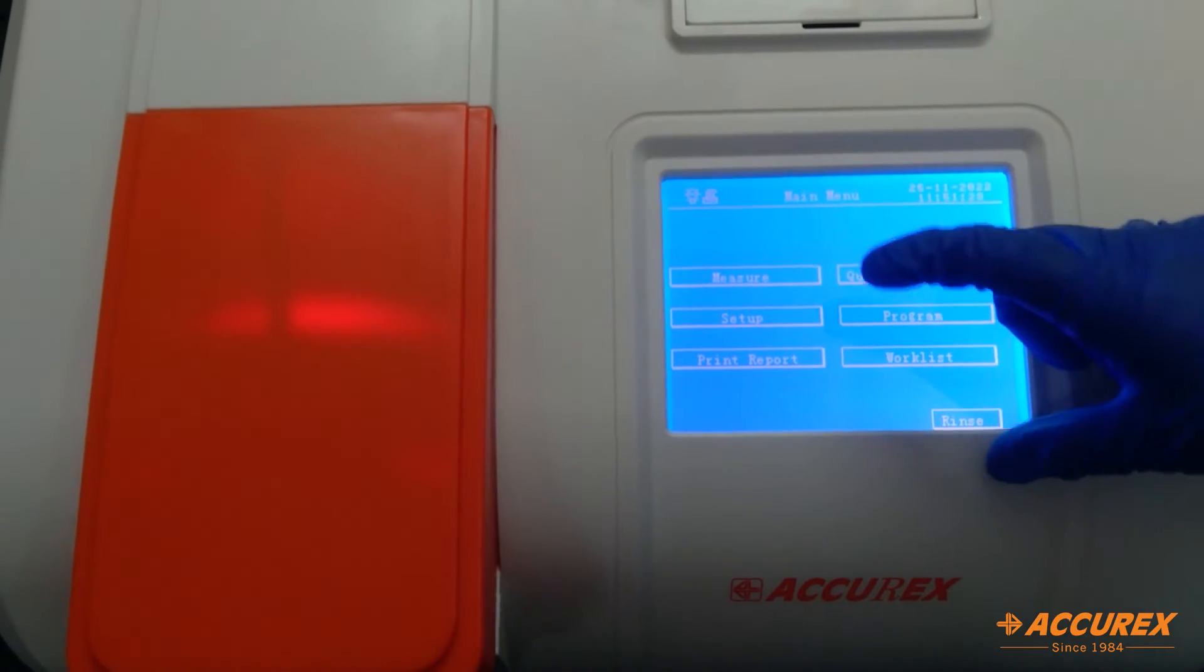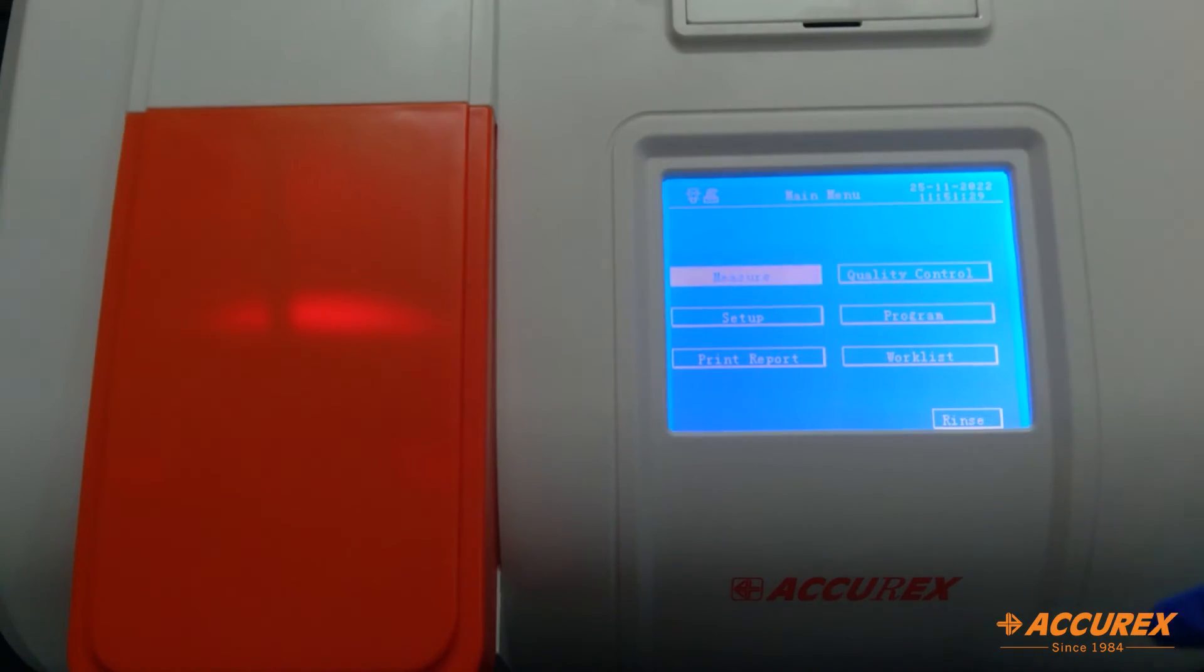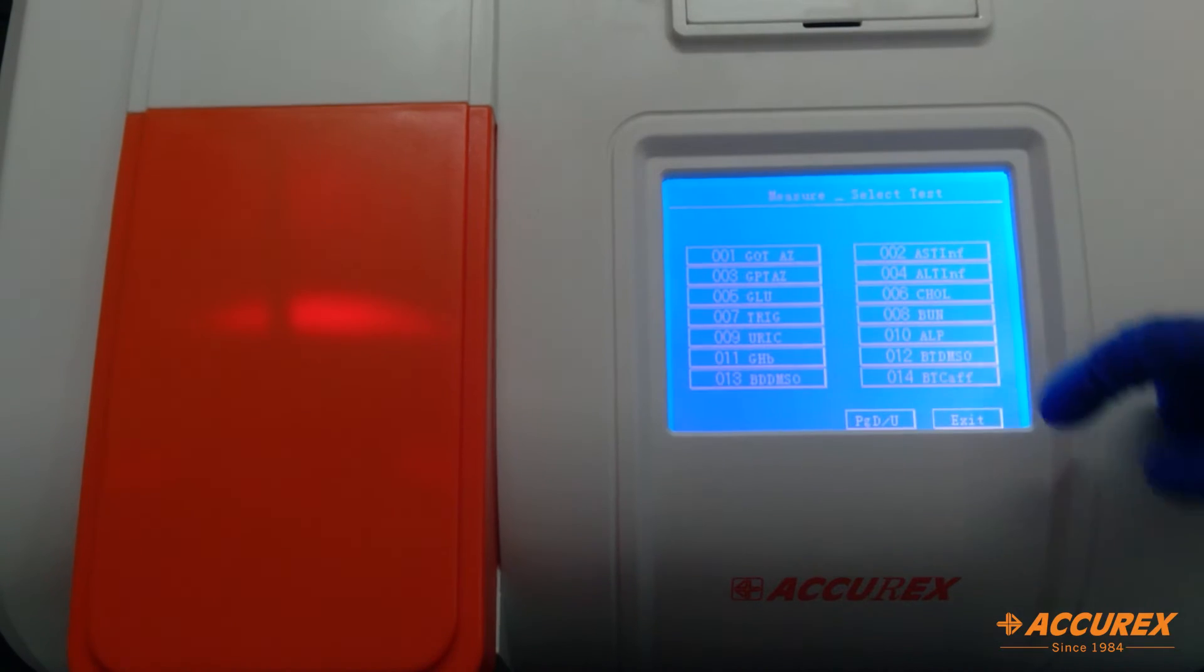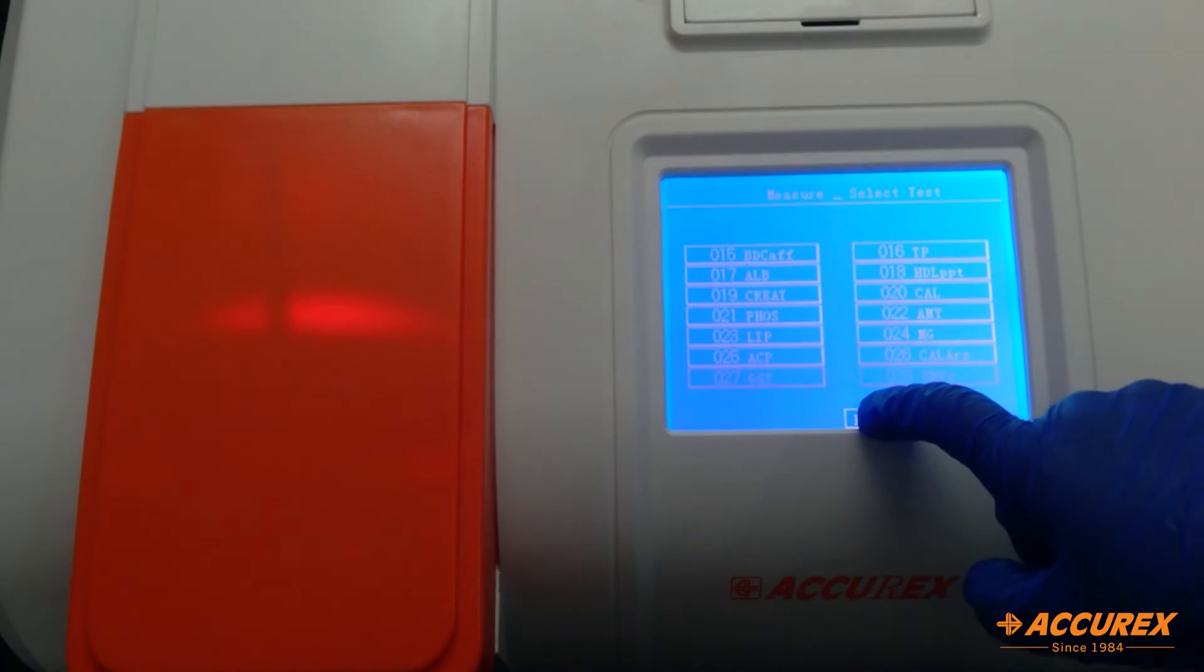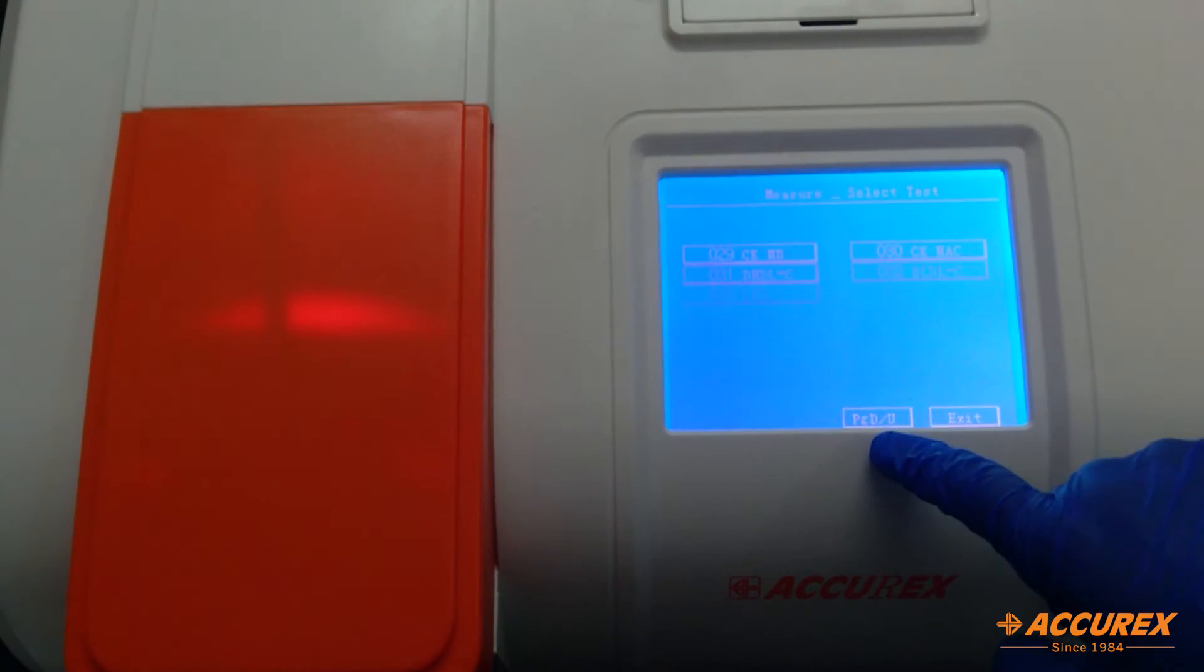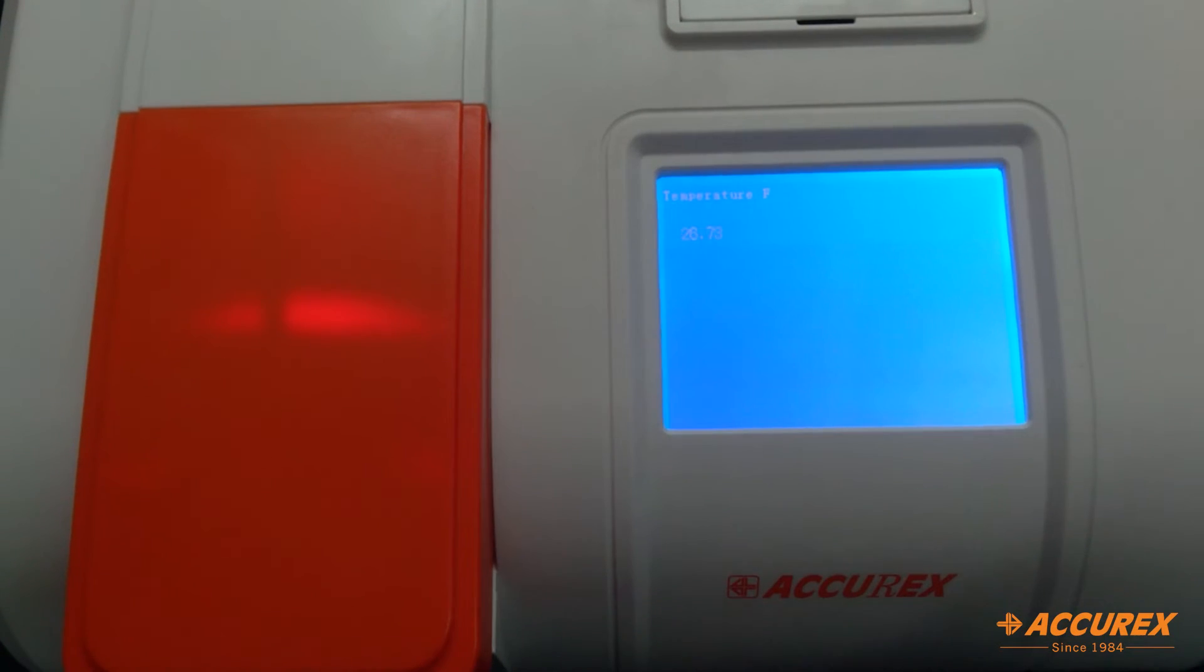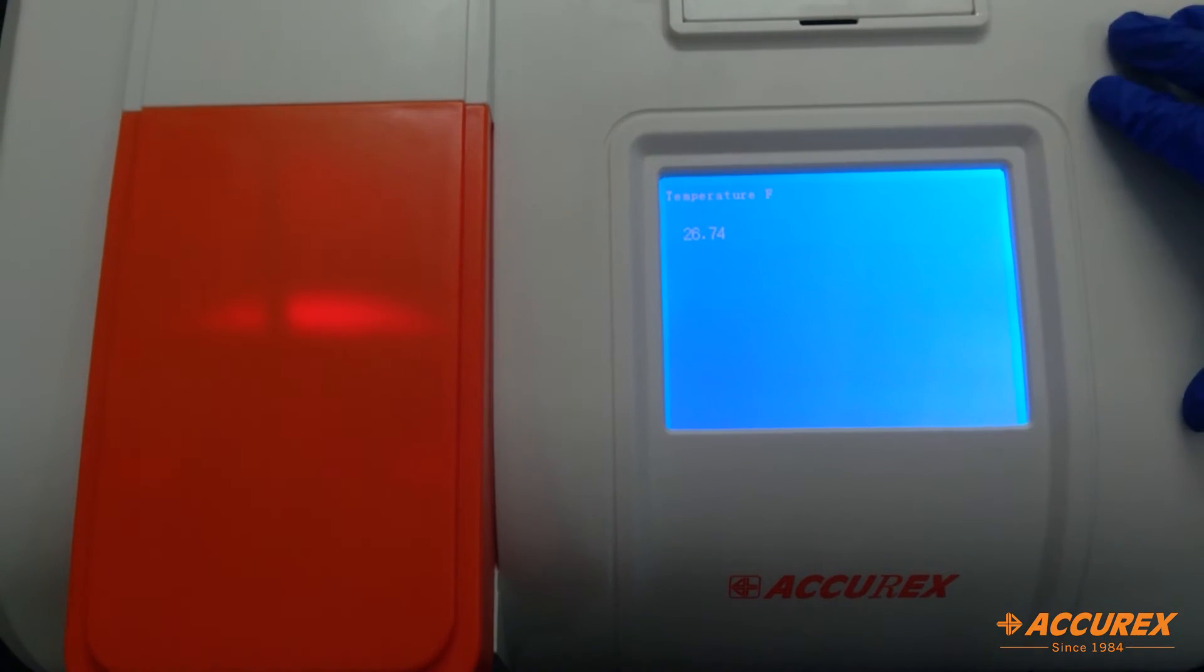Now to measure the test you need to click on measure, and from this page down you have to select your test, that is glucose, and this will now set the temperature to 37 degrees.